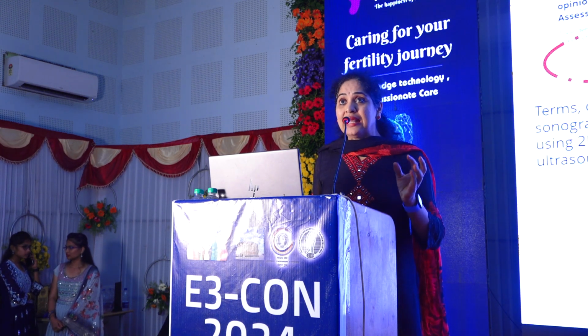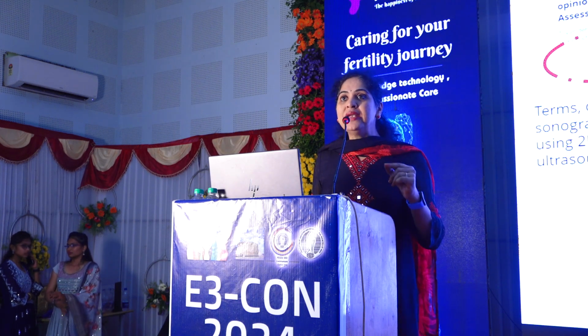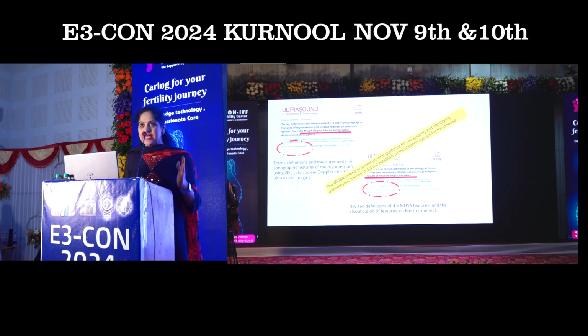Essentially, they mean consensus statements to ensure uniformity amongst the inter-observer operators and speaking the same language. So the MUSA criteria, originally, this paper describes the terms, definitions and measurements to delineate the myometrial characteristics and abnormalities.